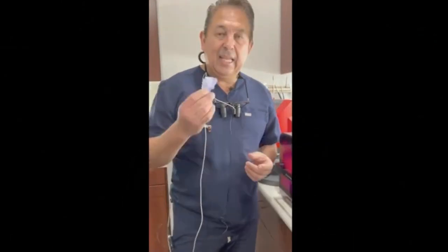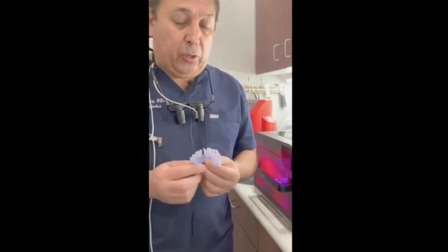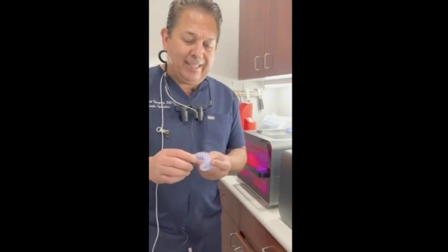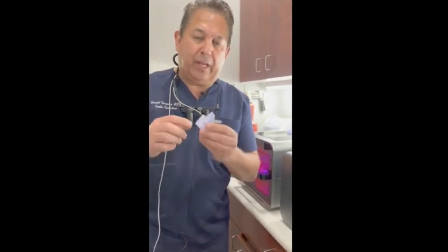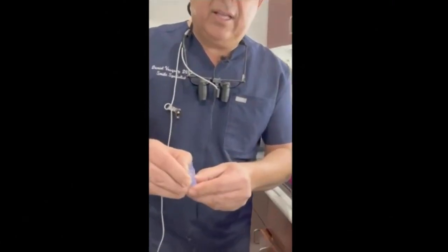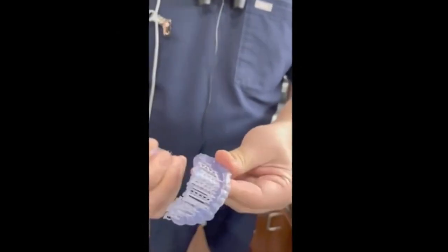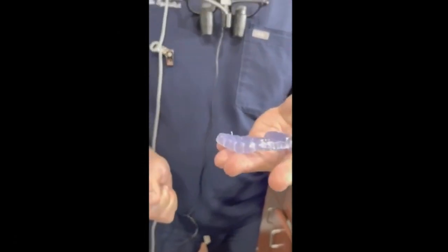The other thing that I like about printing this material in the office is the supports. See how easy they clean? I'm going to get a little cough drop. Okay, so it's already printed. I'm showing that it's already printed. I took the audio out. So that thing just peels off. Look at that. So easy to peel off. And it's one of the services that I really love doing in my practice.